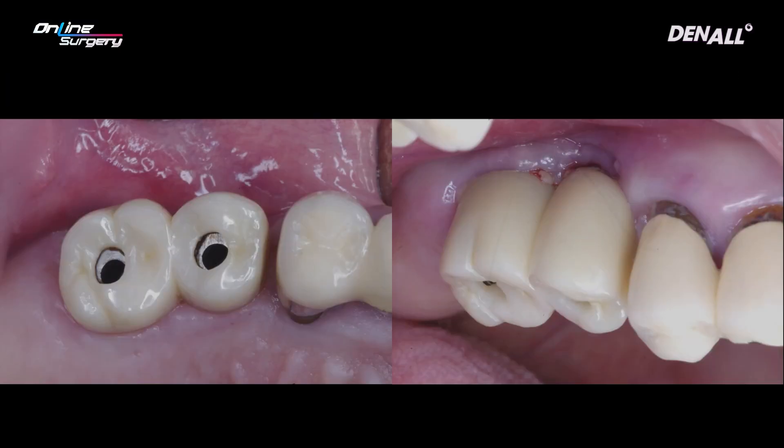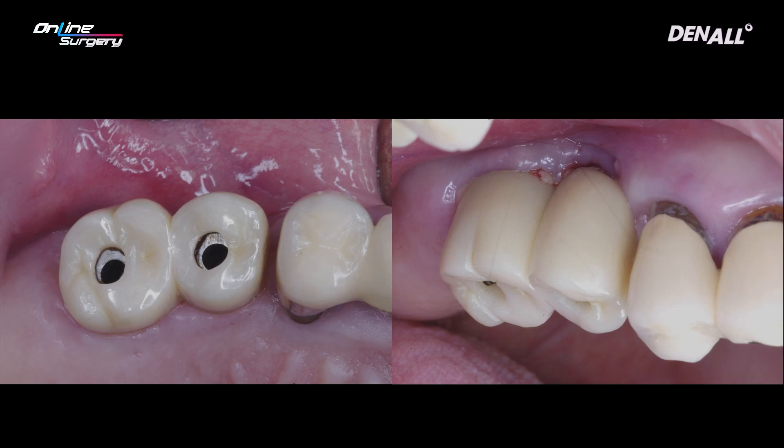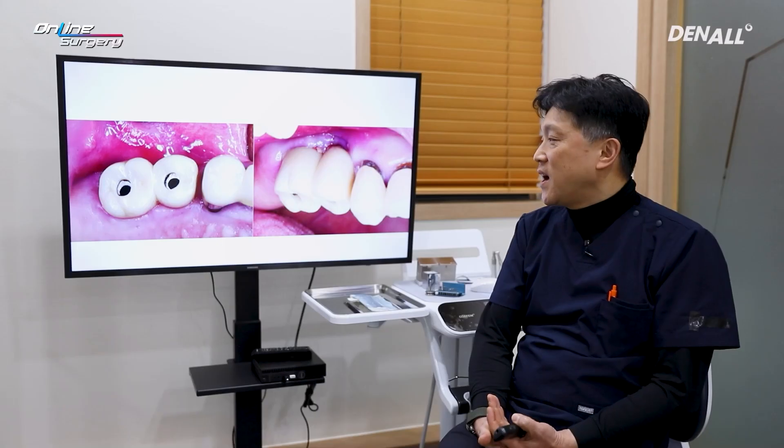This is the pre-op image. As you can see, the two implants were splinted. The contact was quite loose, and towards the buccal side there was a lot of exudate. Let's look at the surgical clip first.